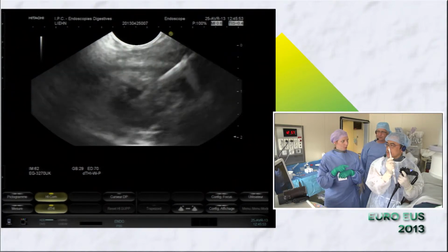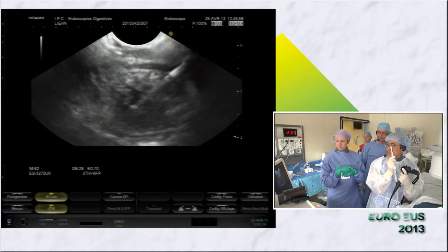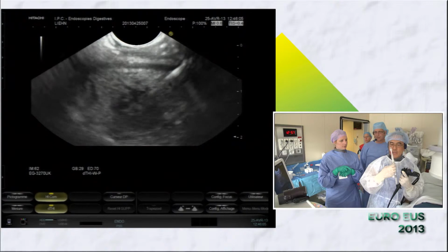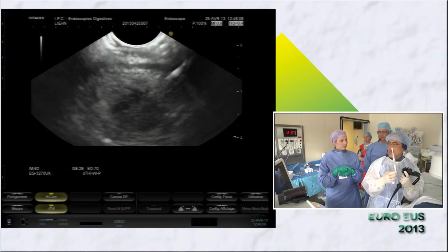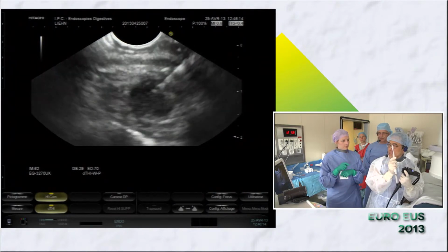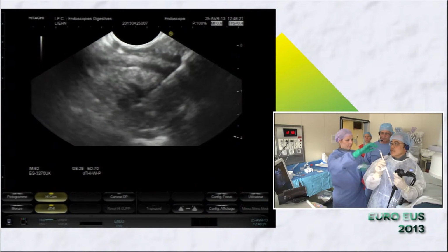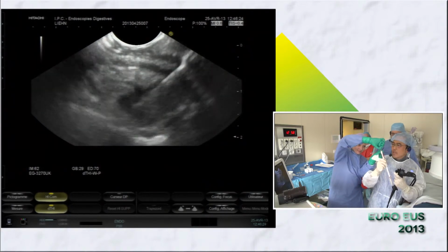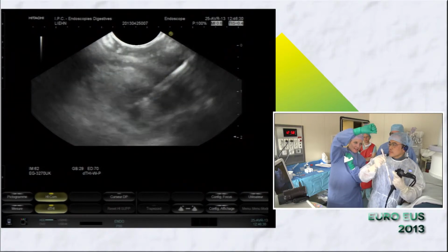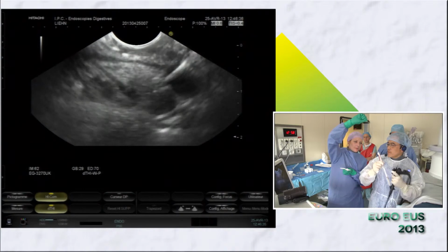Okay, so the idea is to get into the lesion, and then I'm going to advance to the far end of the lesion. And then I'm going to take my guard and lock it down. That way, I know the furthest extent of my needle. So now I'm going to do this, and you're going to slowly pull the stylet. Go ahead. Ready? So you see we're doing many back and forth.